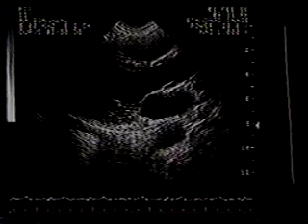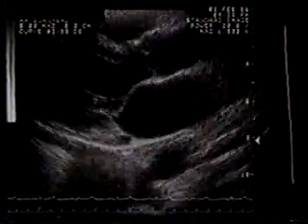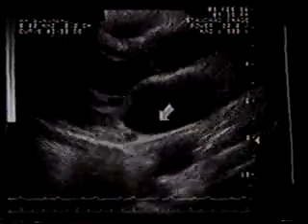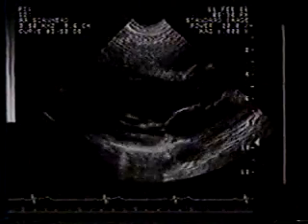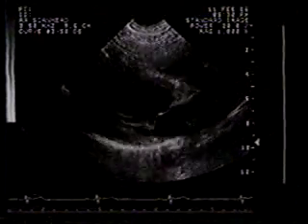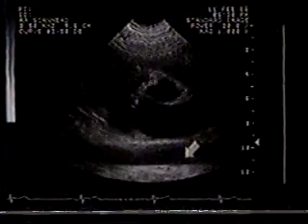We will focus on the coronary sinus using the zoom feature of the instrument, which is ideal for inspecting smaller structures. Note once more the location of the coronary sinus, in the atrioventricular groove, anterior to the descending thoracic aorta, which is also seen in short axis. Maintaining the left parasternal position, the transducer is rotated clockwise to develop the long axis view of the descending thoracic aorta.